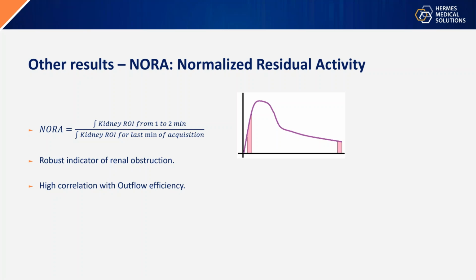One of the main changes is that the bolus technique used during Hilson's time was called the Oldendorf bolus technique, where you put a ligature on the patient's arm, inject underneath that, and then let it go. So you have a big proper bolus. And also he was injecting probably twice as much activity, so it was much less noisy. I think you'll find if you try to do the processing on these cases, often it's very tricky to see the iliac artery, which is what you're trying to draw as part of that measurement. So we found for our clinical practice at Bart's Hospital that it's not a reliable measurement.